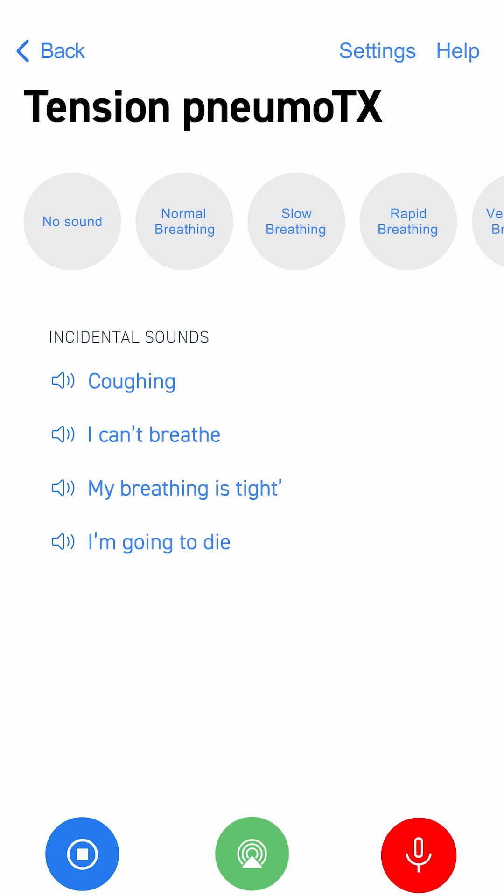I can't breathe. Or use the push-to-talk option to record custom audio.